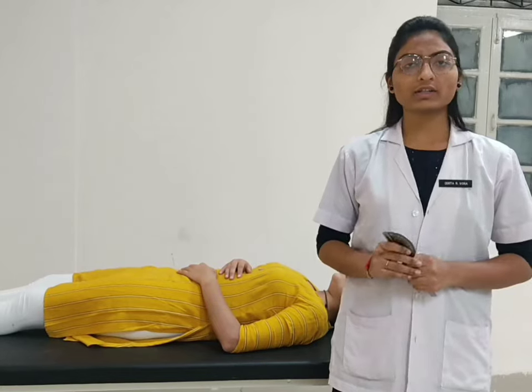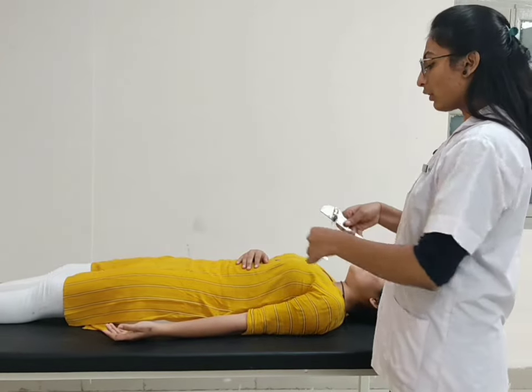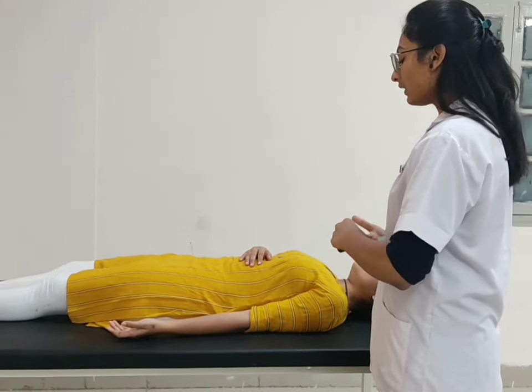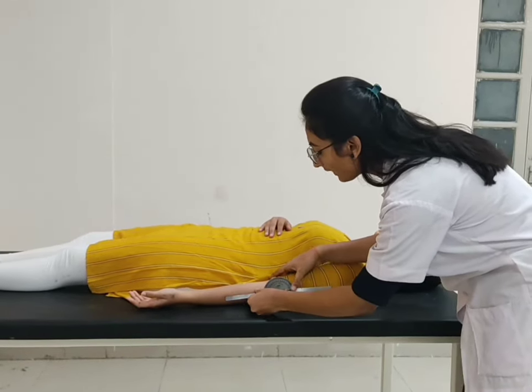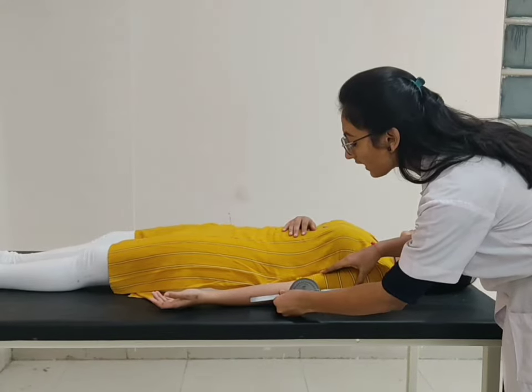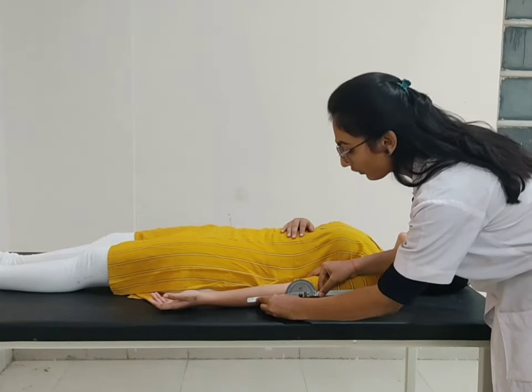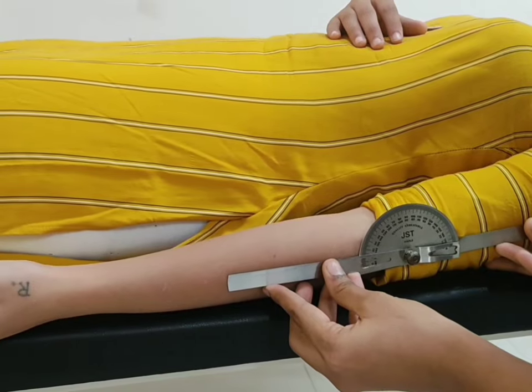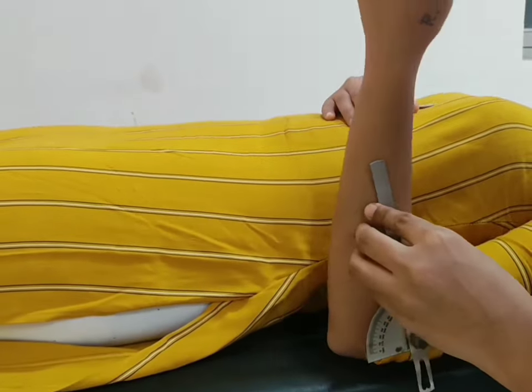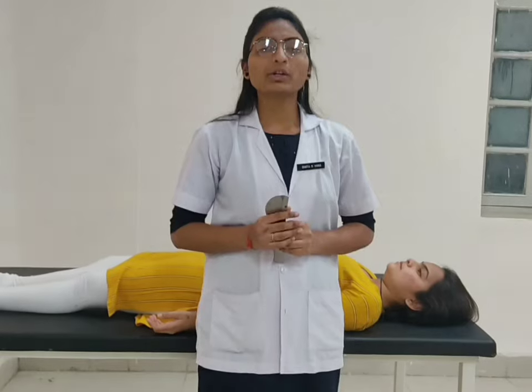For elbow flexion, patient position supine with arm facing towards the ceiling. Place the fulcrum over the lateral epicondyle of the humerus. Stable arm parallel to the mid-line of the lateral aspect of the arm and moveable arm parallel to the mid-line of the lateral aspect of the forearm. Ask the patient to bend your elbow. Normal range of motion for elbow flexion is 145 degrees.